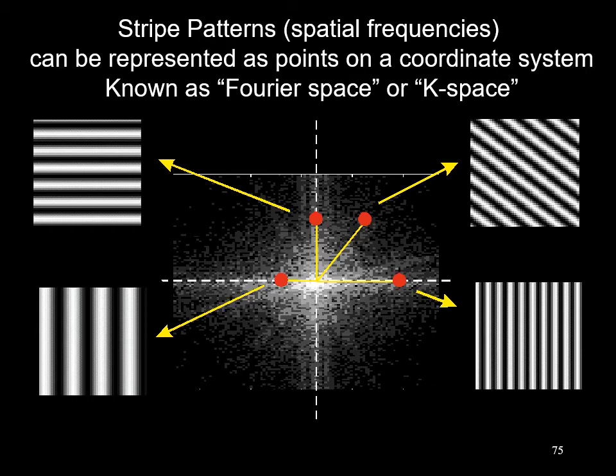So if you look at the typical K-space representation, it looks like a series of dots distributed in the 4 quadrants of K-space. Each of those dots represents a series of stripes of different amplitudes, obliquities, and frequencies. And if all those stripes are added up, as I showed you with that Picasso vase, you will get an image of the head.